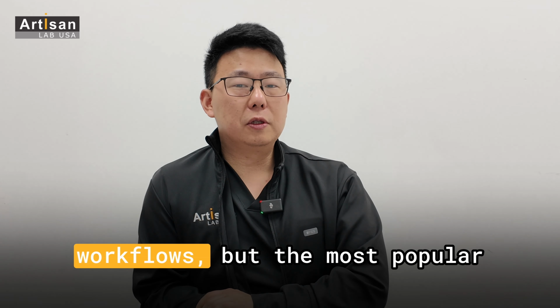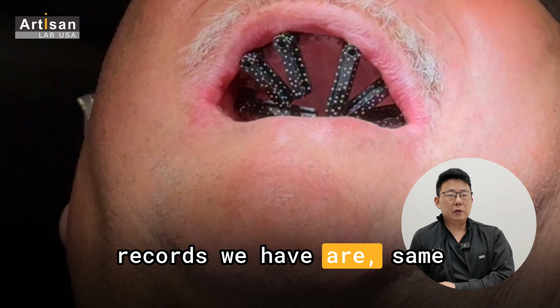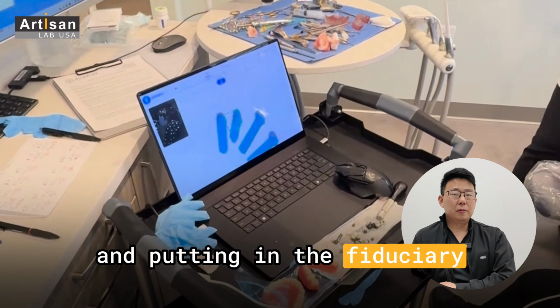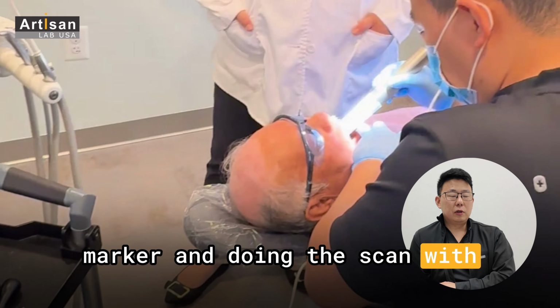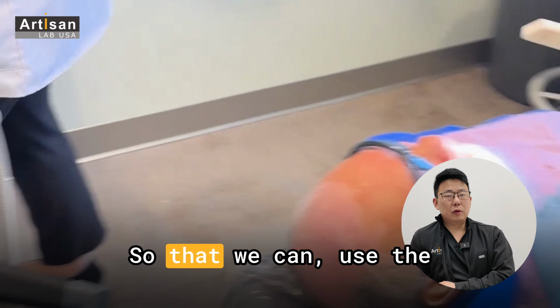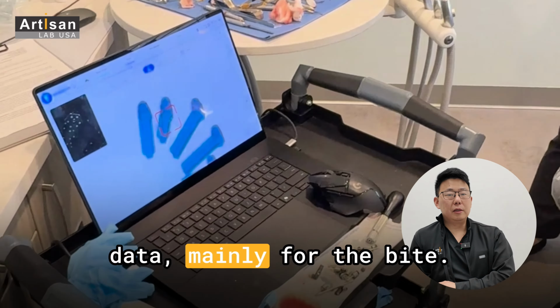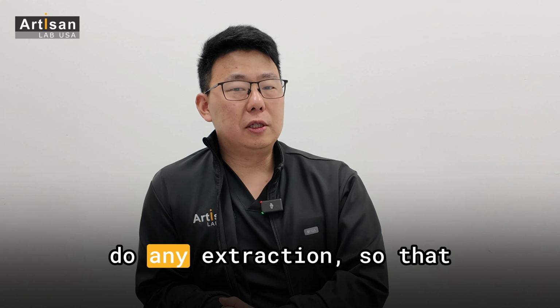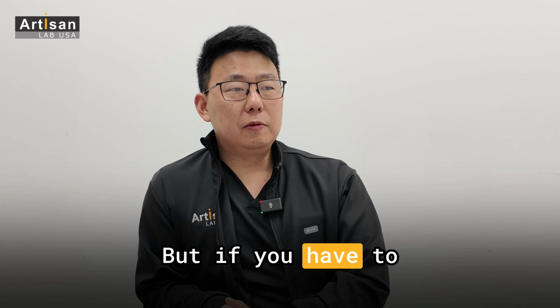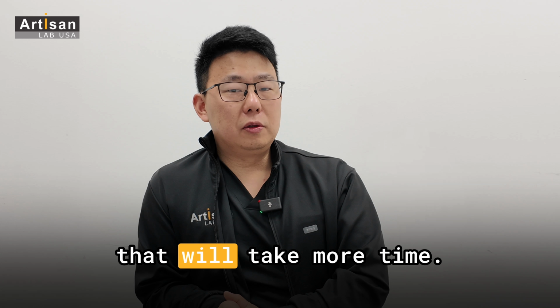There are a few different workflows, but the most popular workflow now is checking that the records we have are the same as inside the patient's mouth, putting in the fiducial marker, and doing the scan with the marker prior to extraction or before the surgery, so that we can use that fiducial marker to come back to the original data, mainly for the bite. Sometimes we don't have to do any extraction, so that extraction time will be saved. But if we have to do more complicated extraction and bone reduction, then that will take more time.